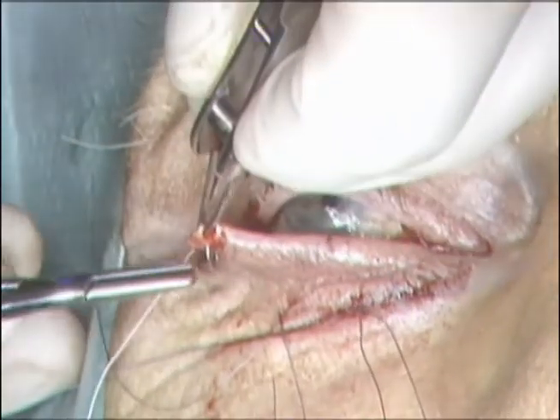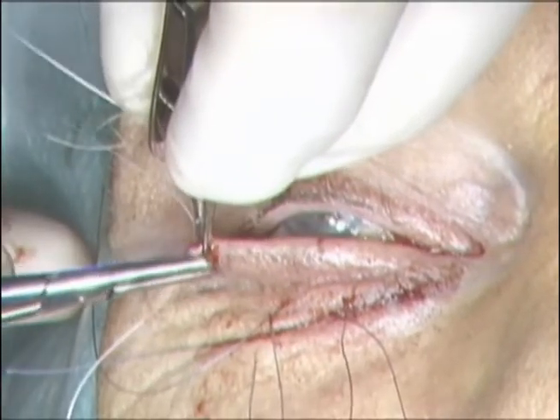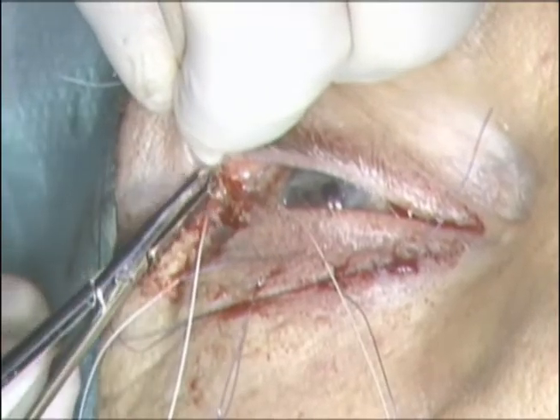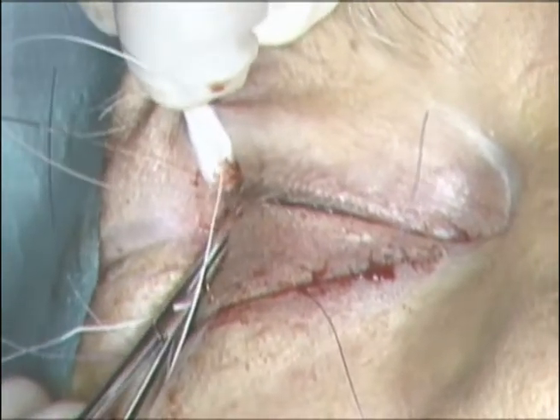The strip is then shortened the appropriate amount. A double-arm 4-0 Mersilene suture on an S2 needle is then used to engage the strip. The lateral tarsal strip is then sutured to the lateral orbital rim at the level of Whitnall's tubercle.